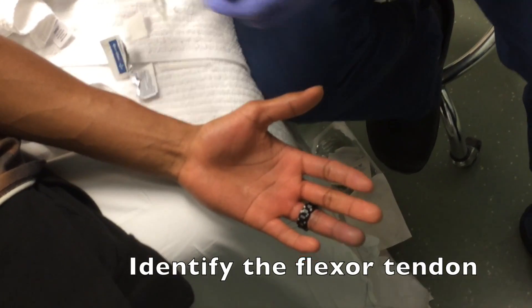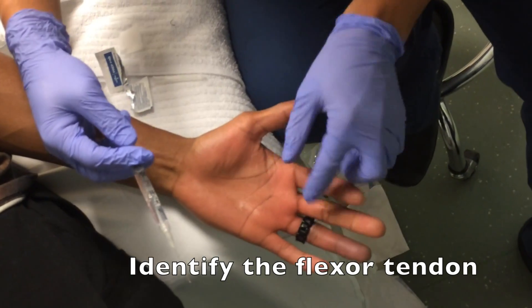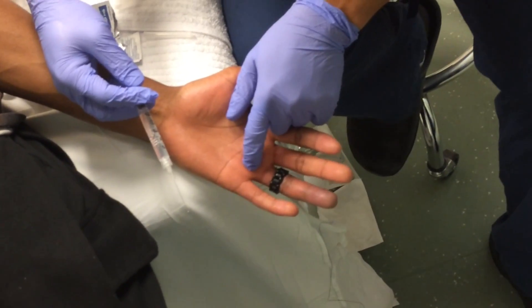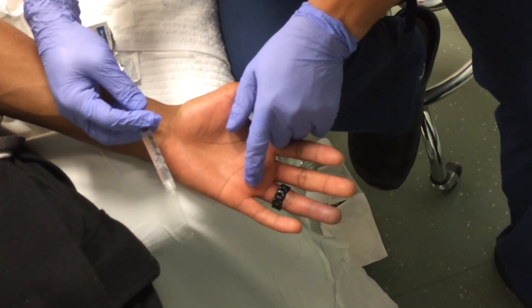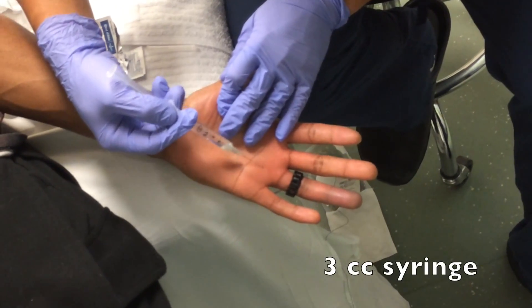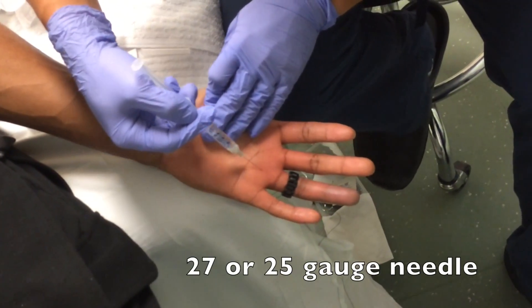In this technique, the first step is to place the hand palm face up and carefully identify the flexor tendon. You can do this by palpating directly, and if there's any doubt, have the patient flex and extend the finger to identify the tendon. You'll use a 3cc syringe with a 27 gauge needle attached.